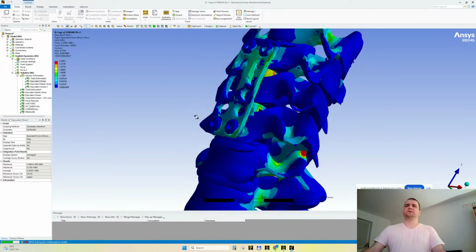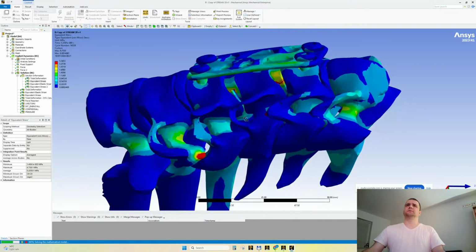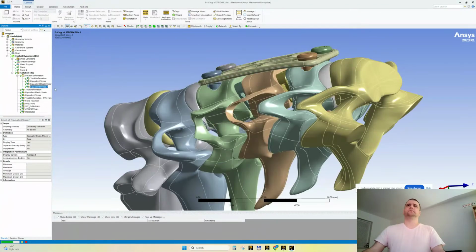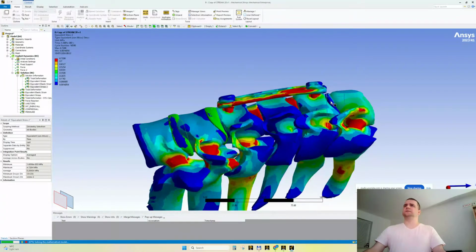Normally the stress should be scoped. We should differentiate softer bodies against harder bodies. Look what I was talking about. So let's select softer bodies. This is soft. This is soft. This is soft.